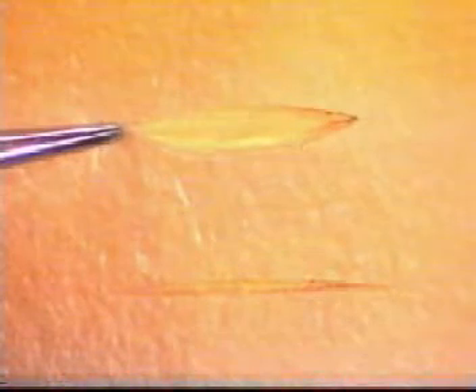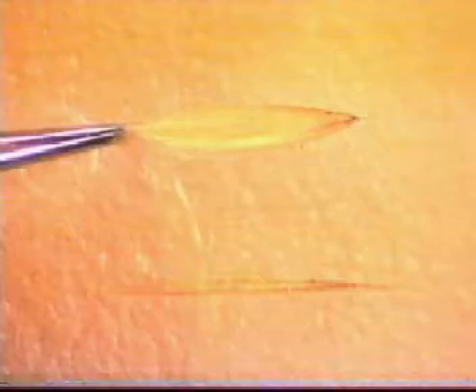There may be two types of wound you will be required to close. One, a linear wound, as you see here. The other, an elliptical wound. If you have to make an elliptical wound, try and ensure that the length of the ellipse is at least three times its width.